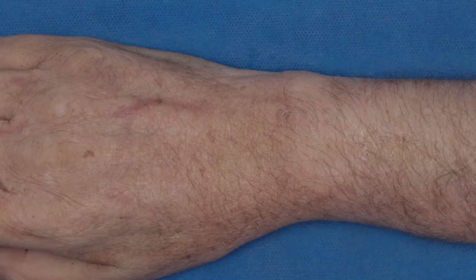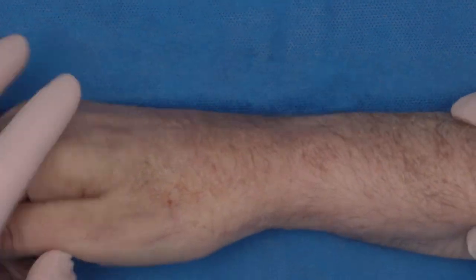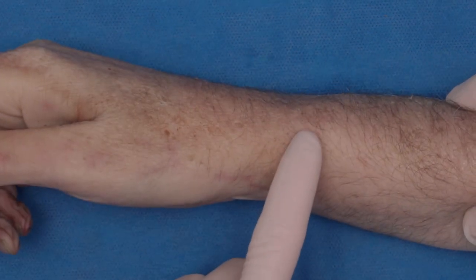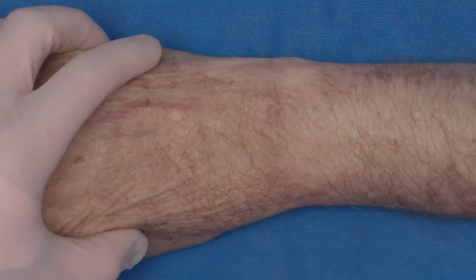For the procedure to collect the bone graft, typically for most upper extremity procedures, you use a tourniquet. The technique I talk about involves going dorsal — I'm a fan of using the incision that you've already created. For instance, if you are going a dorsal approach, you can use that. Otherwise, you can go into the radial styloid and basically just use the incisions that you've already created.